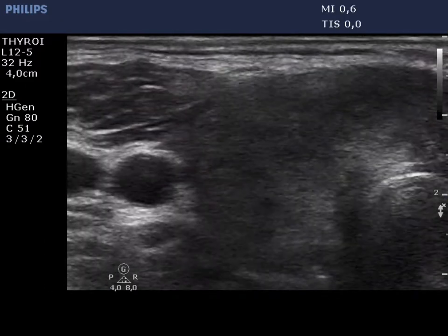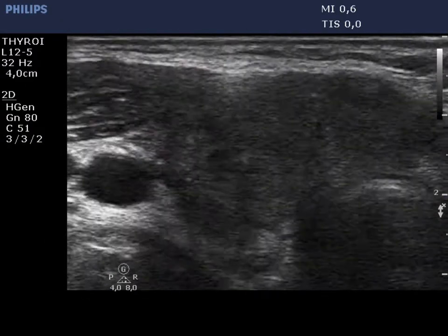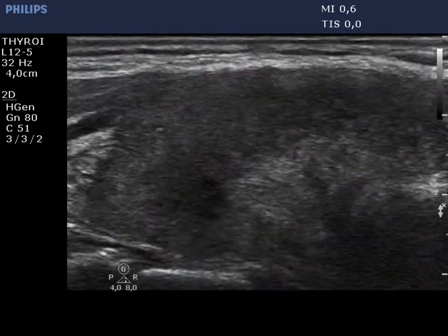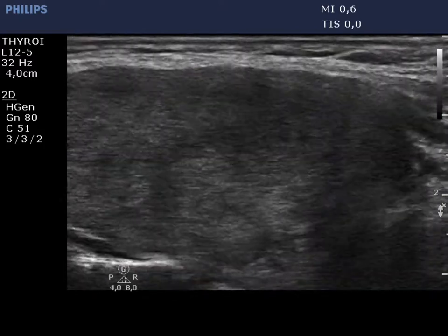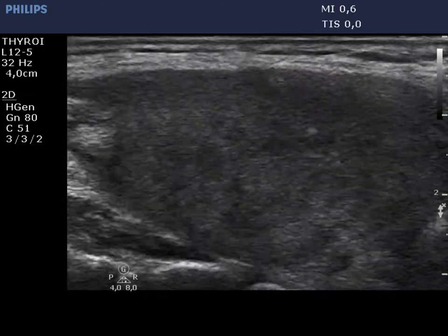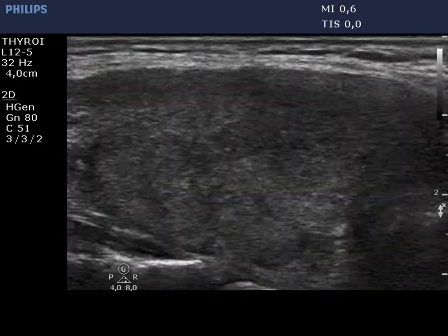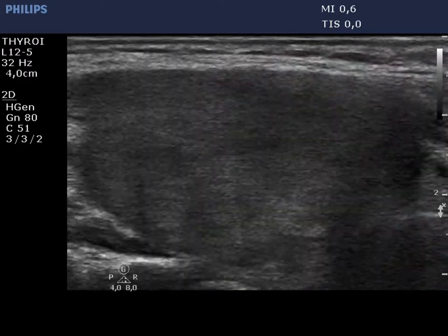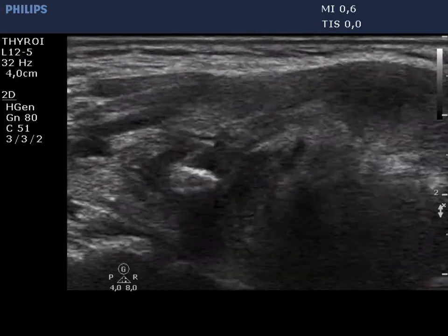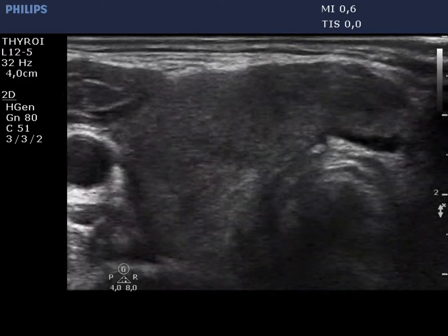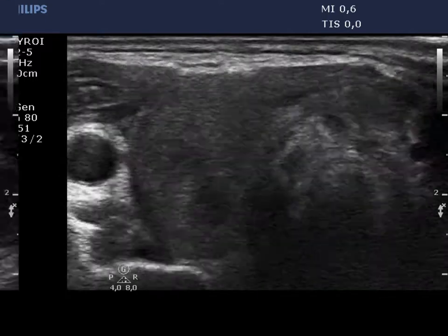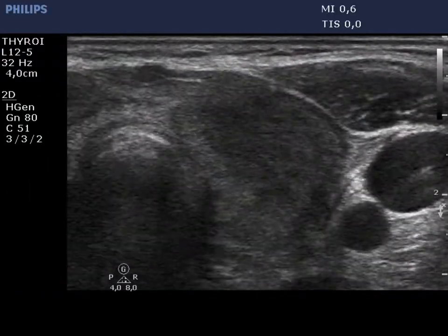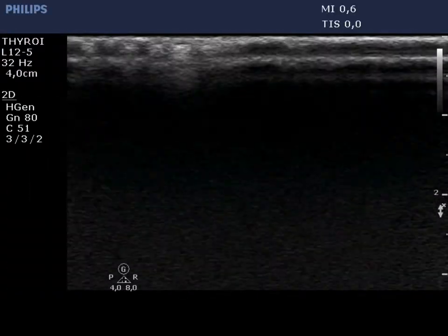The thyroid is enlarged. Both lobes are minimally hypoechoic, inhomogeneous with several more hypoechoic areas. The borders between the areas with different echo patterns are blurred. The pattern is similar in the left lobe.